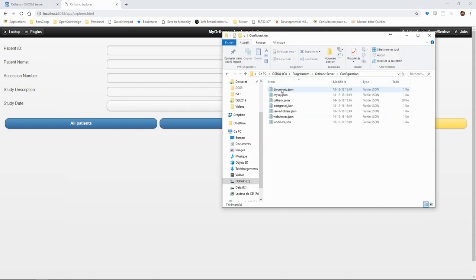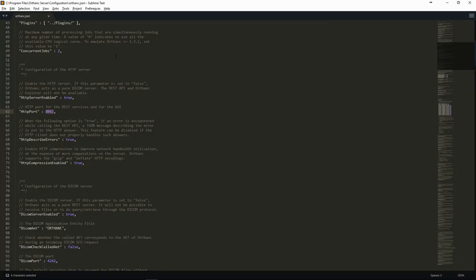Before going further, let's take a quick look at the Orthanc configuration. The configuration is stored as a JSON file.